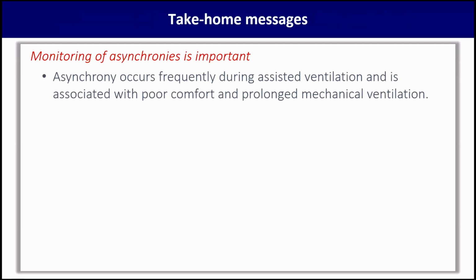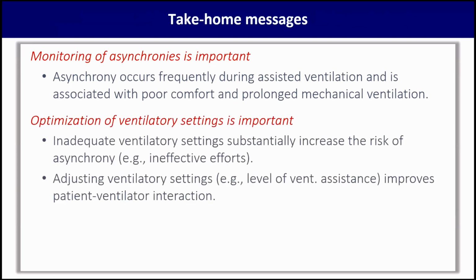This is also associated with a lot of comfort issues for the patient. In some patients, the asynchrony may not only be due to the settings, but also the level of sedation and level of anesthesia. We need to optimize all of that. If you adjust the ventilator according to the patient's needs and identify what the actual problem is by looking at the waveform, it will improve the synchrony.